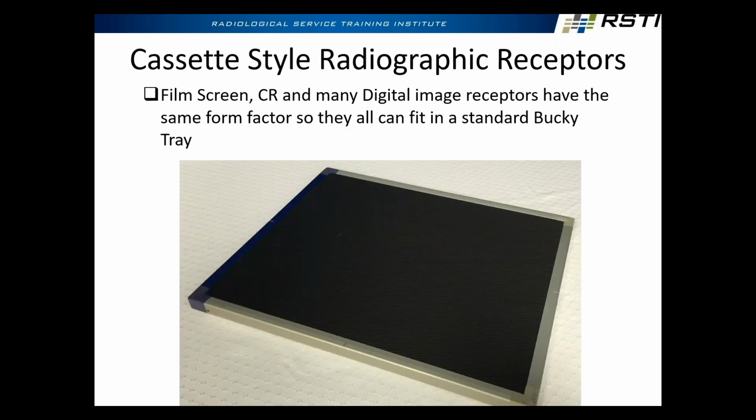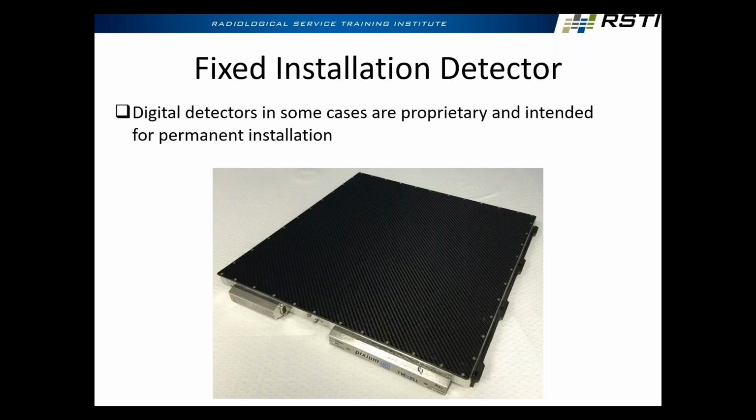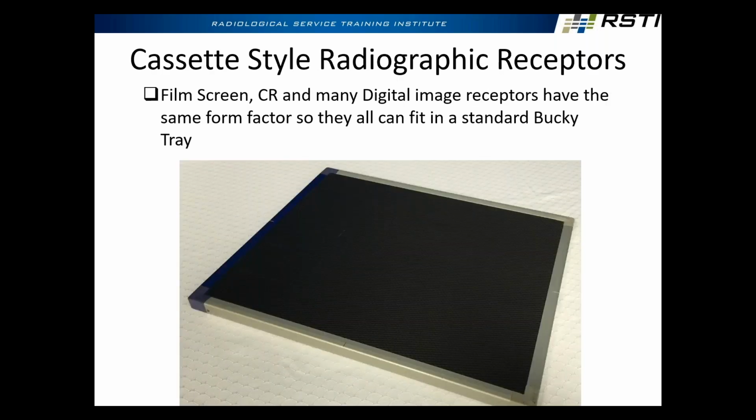Right? With CR systems, computed radiography, this does use a screen. But in this case, it's using europium-doped barium fluorohalide crystals, and the europium is the magic part. Because europium, with these barium fluorohalide crystals, when we expose one of these screens, you'll actually see it glow blue. That's because you're exciting these crystals, and close to half of them are returning to a stable state. When they return to a stable state, they give off blue light.